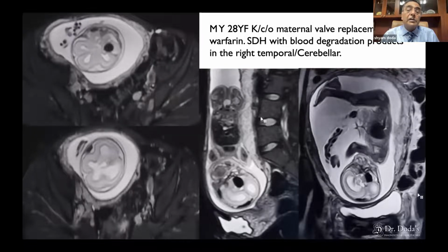Since MRI shows the hemorrhage in various forms, both acute and chronic, right there also we can see the same kind of lesion, but having a dark signal on T2 weighted images. In addition, we could see additional areas of similar thing, and then we had no doubt that this was a subdural hemorrhage in the temporal region, and this was a hemorrhage in the cerebellar region.